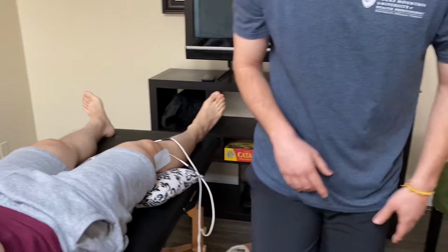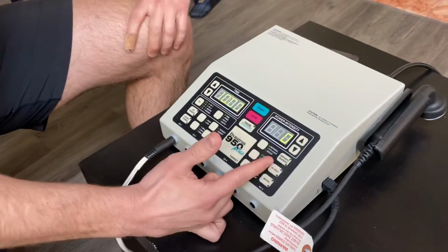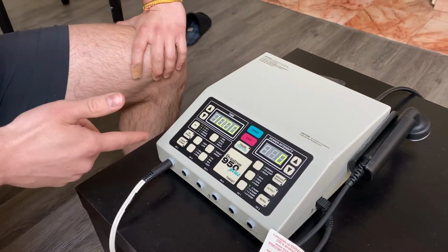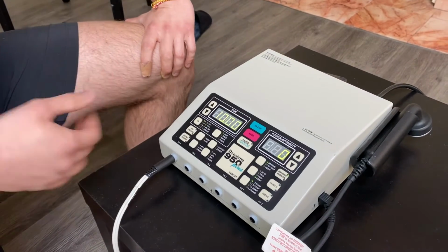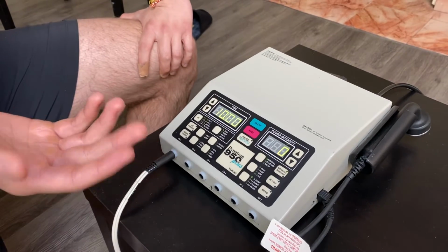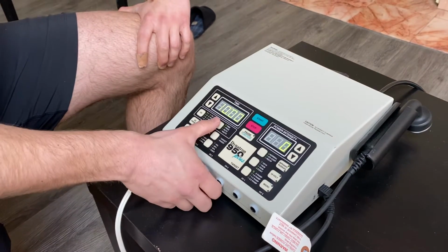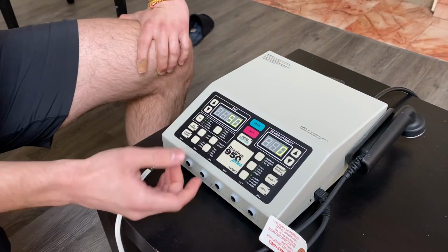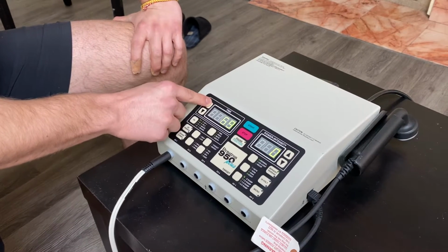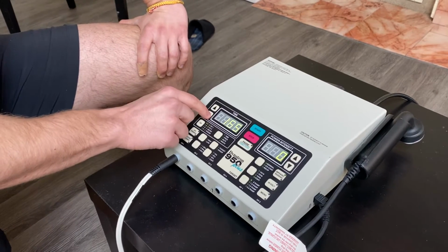Good, and then we can come over here to the machine. So we're doing high rate TENS with this. This is a biphasic pulse current, and it's going to be continuous. If we come over here to the time, usually for the first treatment with TENS, you want to stay on the lower end, maybe half an hour or less, but with subsequent treatments you could go for a few hours if you'd want. Then coming down to rate, we are going to push that up to 80. And for our width we're going to come down to 100.